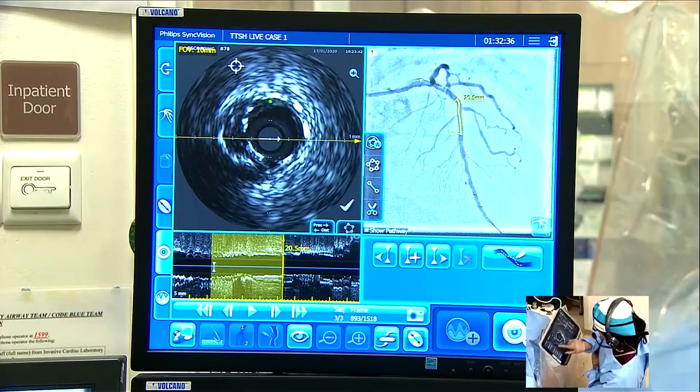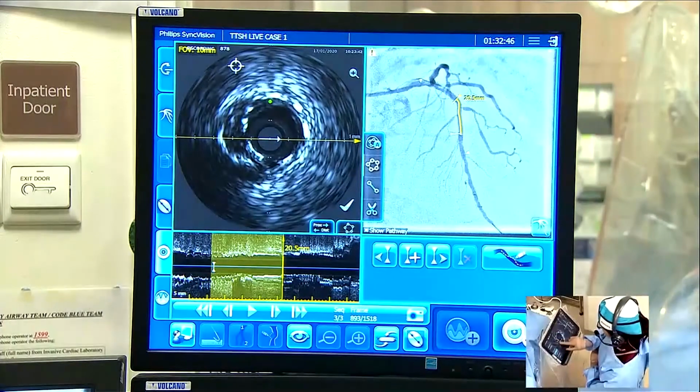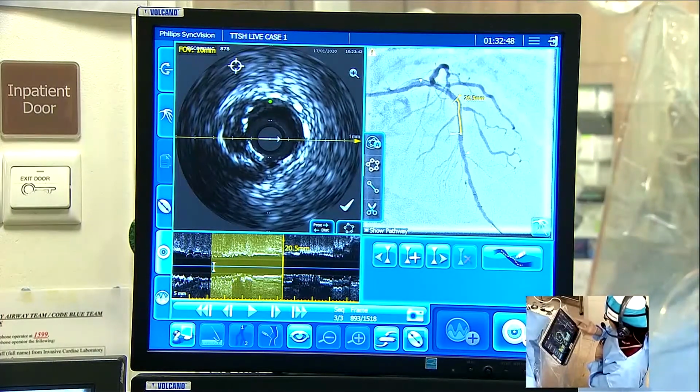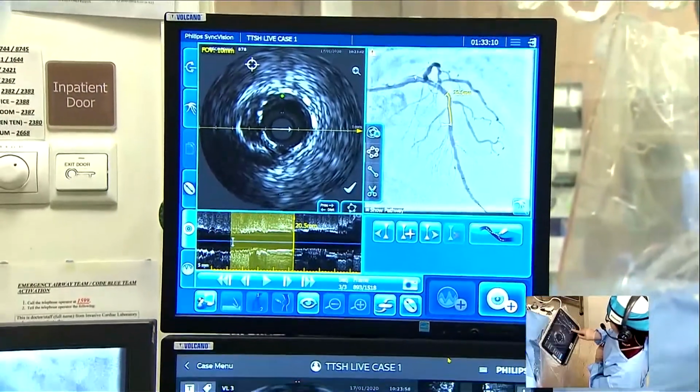Okay. Paul, can you hear us? Are you guys okay with this? Yep, I can hear you. Yeah, I think this is a great illustration of where you've combined the data from the pullback co-registration physiology with the IVUS imaging, because it illustrates the point that you now know the areas potentially to target to give you the biggest benefit and where to leave alone. But essentially, where to implant your stent, how big to have the stent, and obviously to assess if it's been successful. Using the imaging in this very iterative way is very appropriate and good practice, I think, and you've executed here brilliantly.